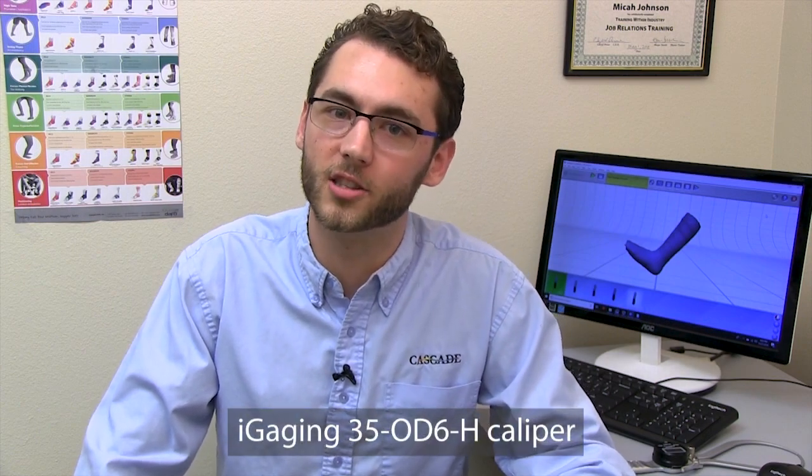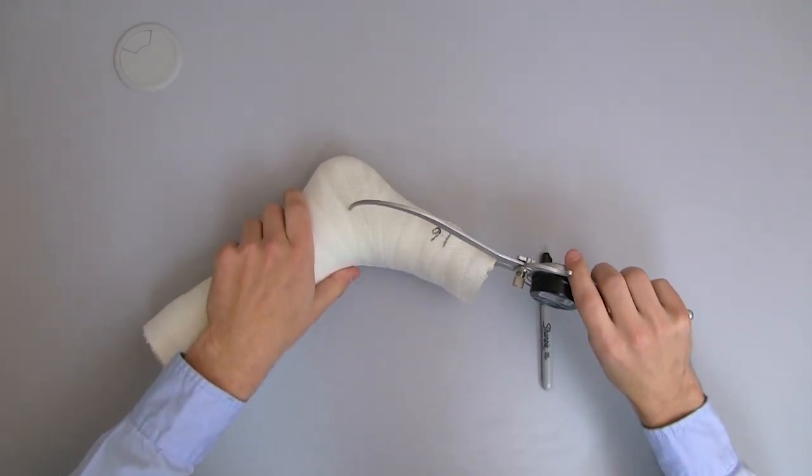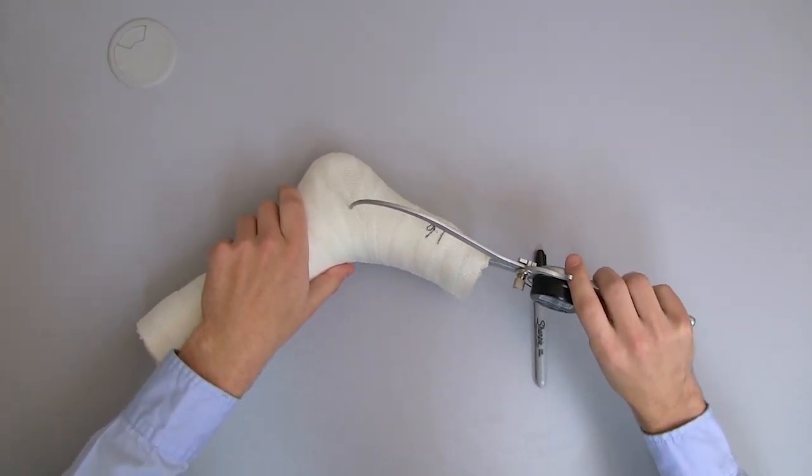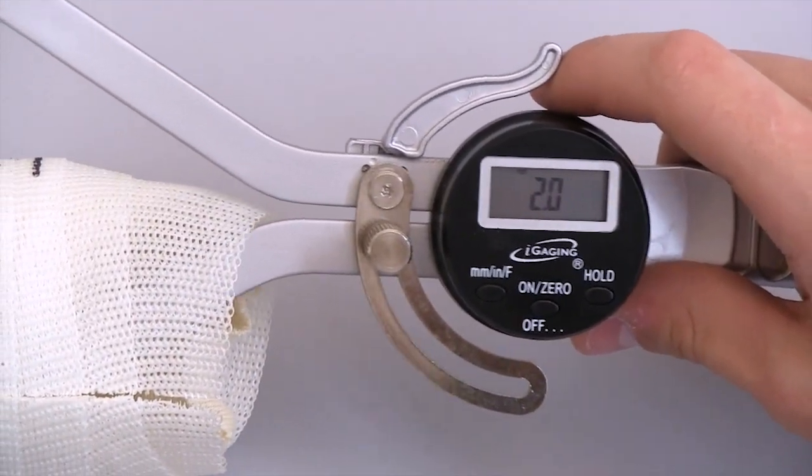The calipers we are recommending are the iGaging 6-inch digital calipers. We prefer these calipers because they have a large mouth that allows you to measure deep into the cast and they're very accurate at measuring small thicknesses. We'll be dealing down to the tenth of a millimeter.